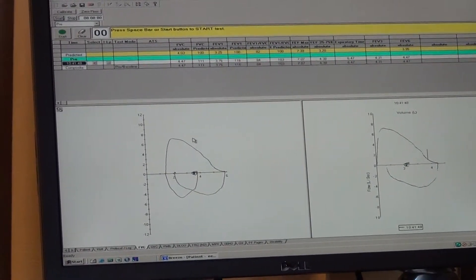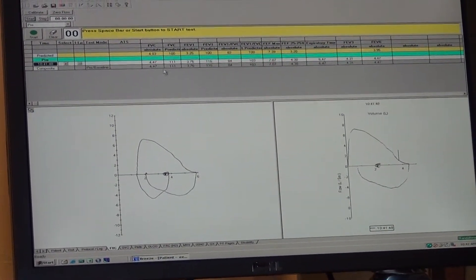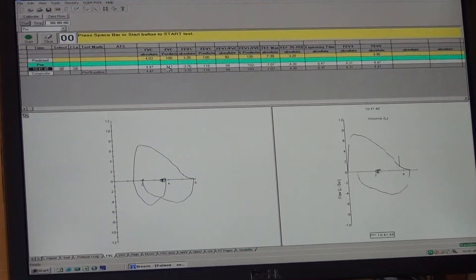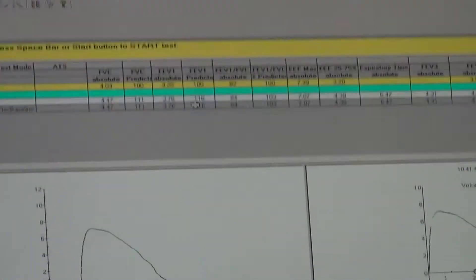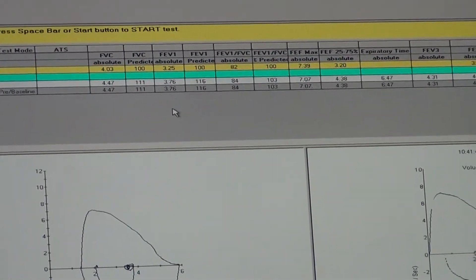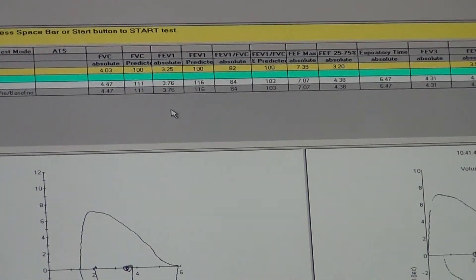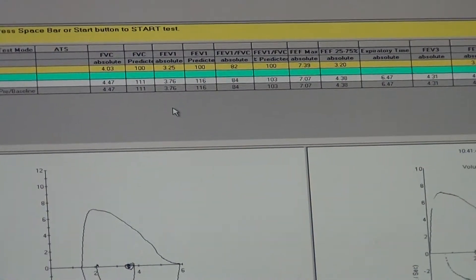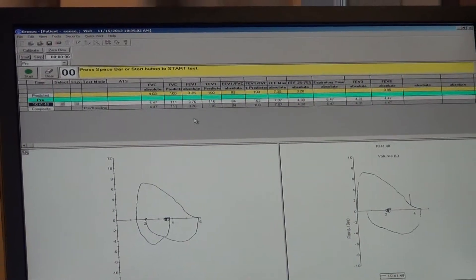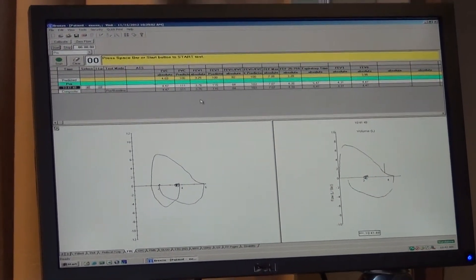On the top you can see the values and the predicted percentages. You can compare the liters and the percentage based on the predicted values for the forced vital capacity and the forced expiratory volume in one second — those are the two main measures we look at. There should be at least one minute between attempts, so let's say one minute has passed. Let's do it again.